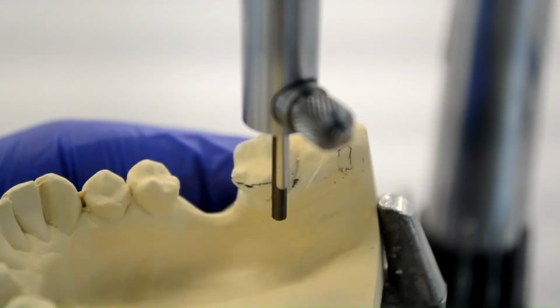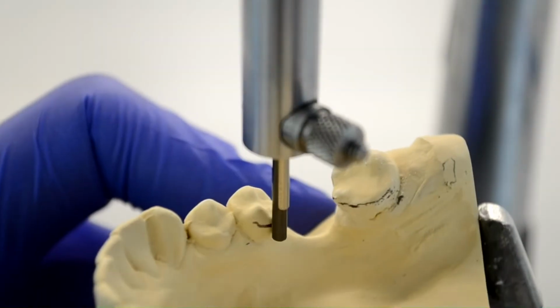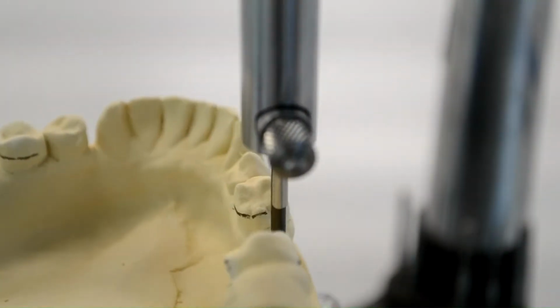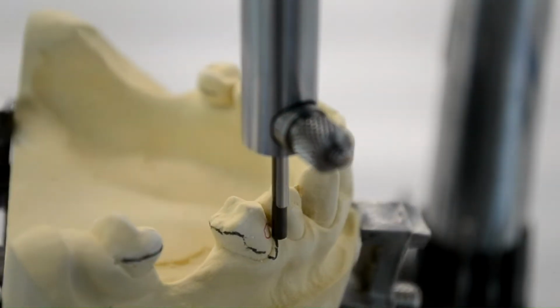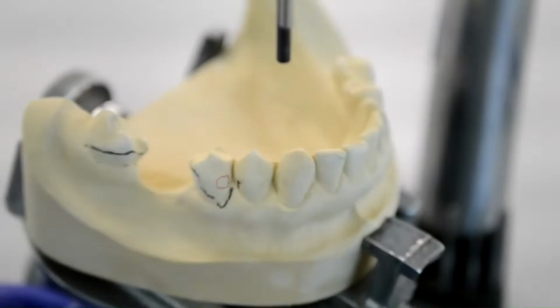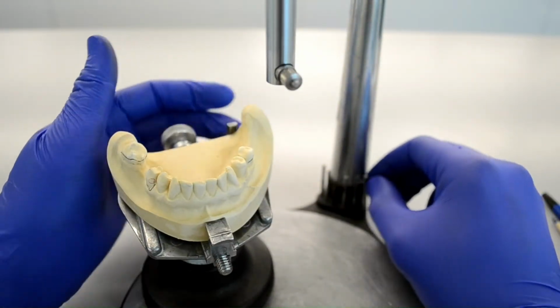Notice how I'm using both my hands to undergo this procedure. The left hand is gripping the base of the table and is used to move the cast around, and the right hand is moving the mandrel up and down and around to ensure that only the side of the lead contacts the tooth.